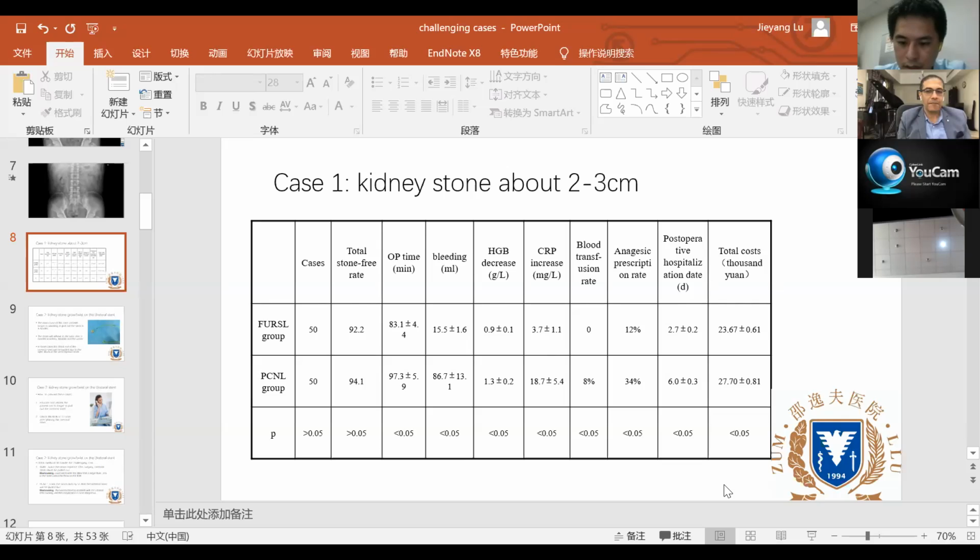We hear you. Yes. Regarding the same case, do you think thulium lithotripsy has an advantage of reducing the time for larger stones? They mentioned they're using thulium lasers. Regarding time, maybe thulium is faster than holmium, and they can finish the case in 2 hours even with a larger stone. Actually, we don't have thulium in Libya up till now, but based on your experience or theirs, will the guidelines change with thulium lasers?